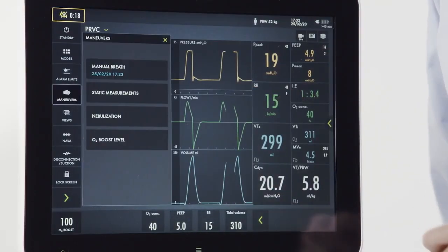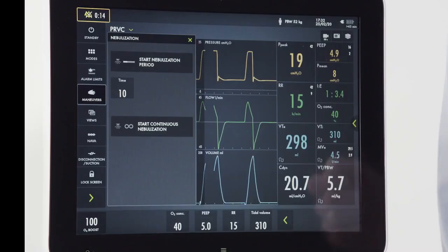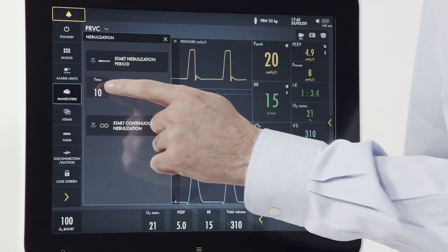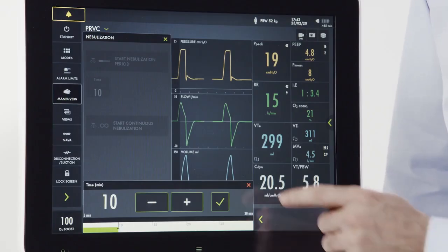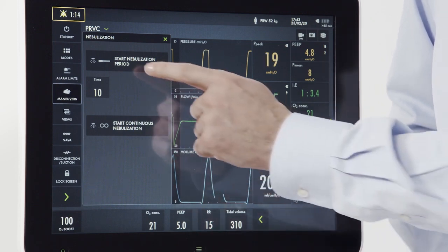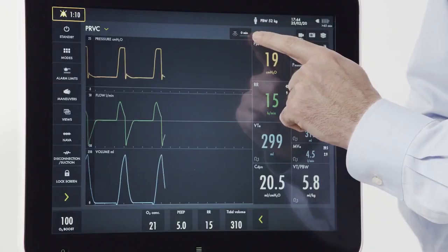Returning to the maneuver screen, we can access our nebulizer. Every Servo-U has an integrated Aerogen nebulizer. From here, you can either set a timed nebulization from 5 to 30 minutes or you have the ability to set a continuous nebulization. To activate the nebulizer, simply press the nebulizer button and you will note on the screen that the nebulizer is active.